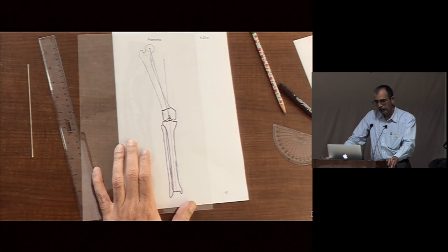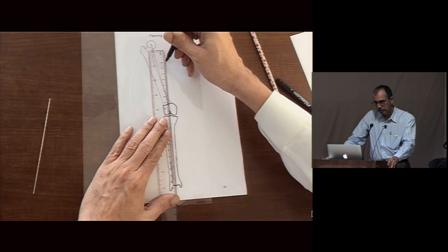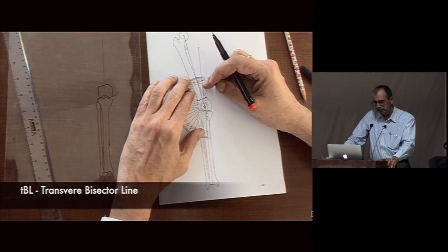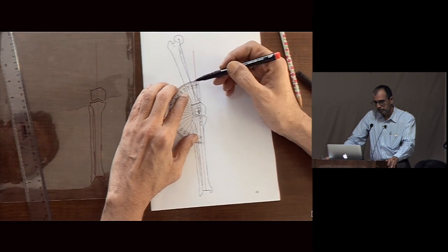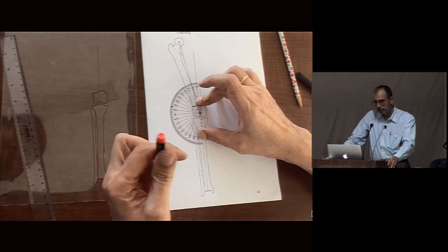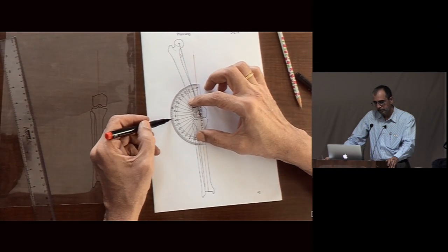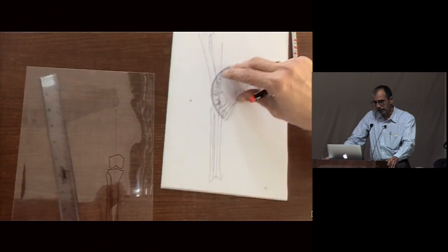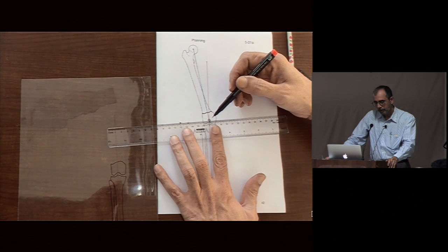All right. So now we are doing the bisector line, which bisects the obtuse angle. That is where I can put my hinges.